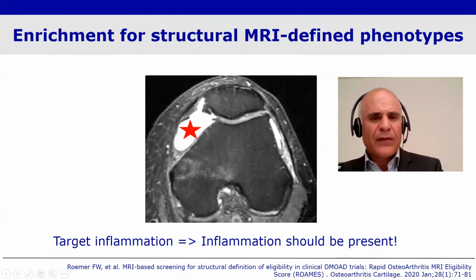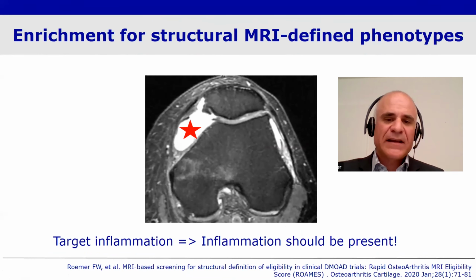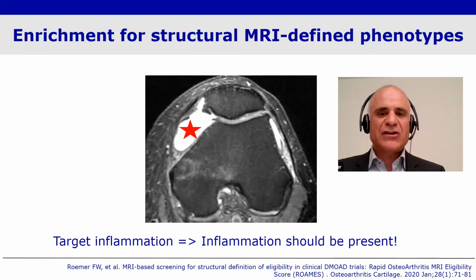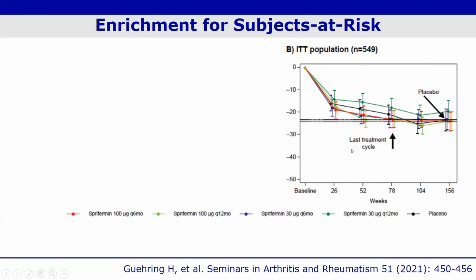And when you have widespread damage, full thickness loss, like in this image, that may not necessarily be the case. Now, moving on to phenotypes, just one single image example here. I said there are different structural phenotypes that can be defined, usually based, for example, on the degree of inflammation. So OA is per se not an inflammatory disease, but it has flares and it has episodes where it shows large inflammation, or subchondral bone may be involved. And given, again, the mode of action of that compound, you may want to consider enriching your sample by that.